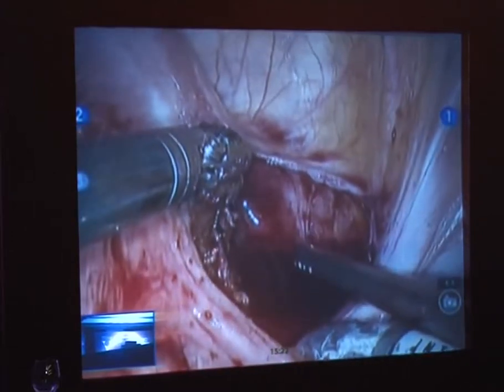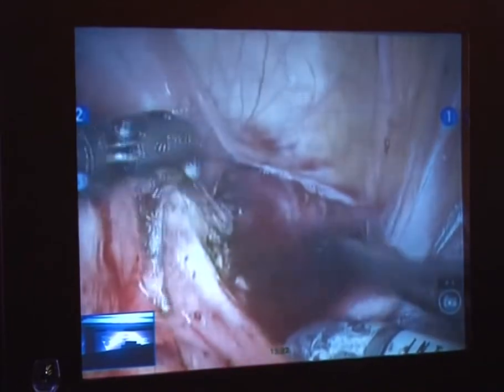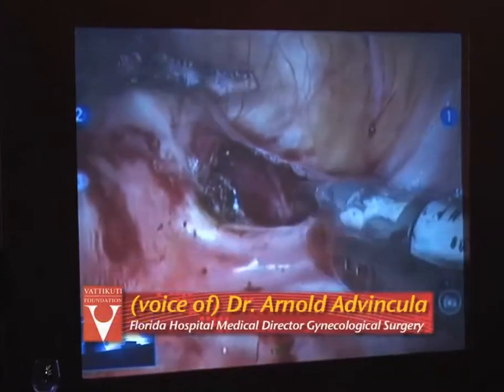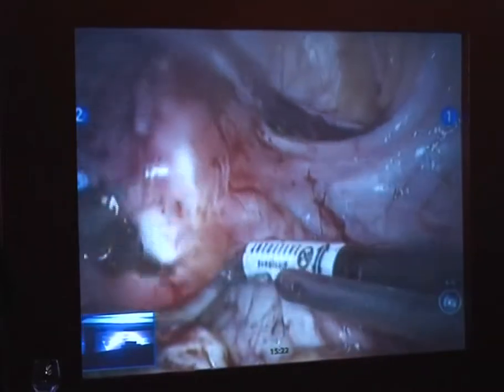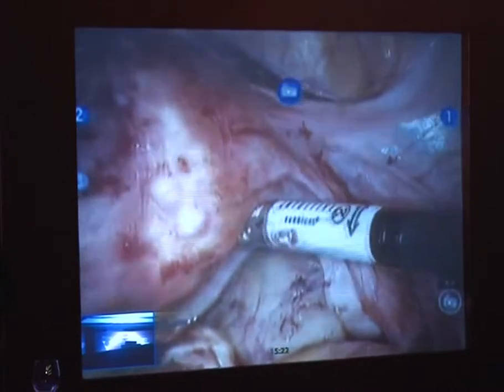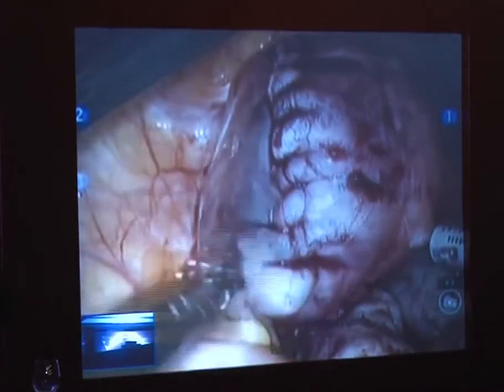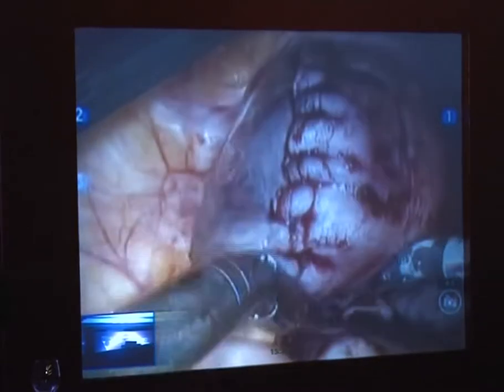I think this is a myoma here, so we're going to have to address that while we're here. So go ahead and retroflex the uterus for me. Can you stop tilting it upward and let it retroflex? Yeah. Yep, another fibroid.